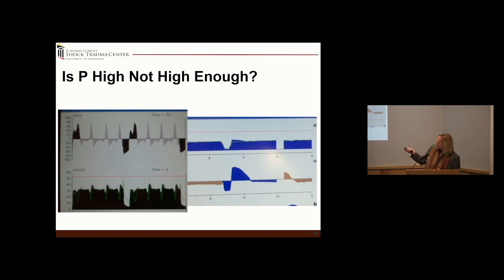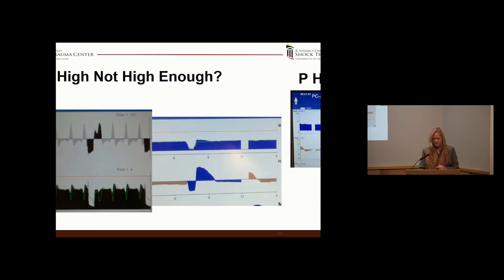Flow characteristics. This is the machine here. This is the patient actually pulling through the machine breath. So the machine flow is 40 liters, where the patient is about 80 liters. So that's a patient really pulling. So you might want to consider that that airway pressure might not be high enough. There's a couple reasons for that, and we'll go over it.